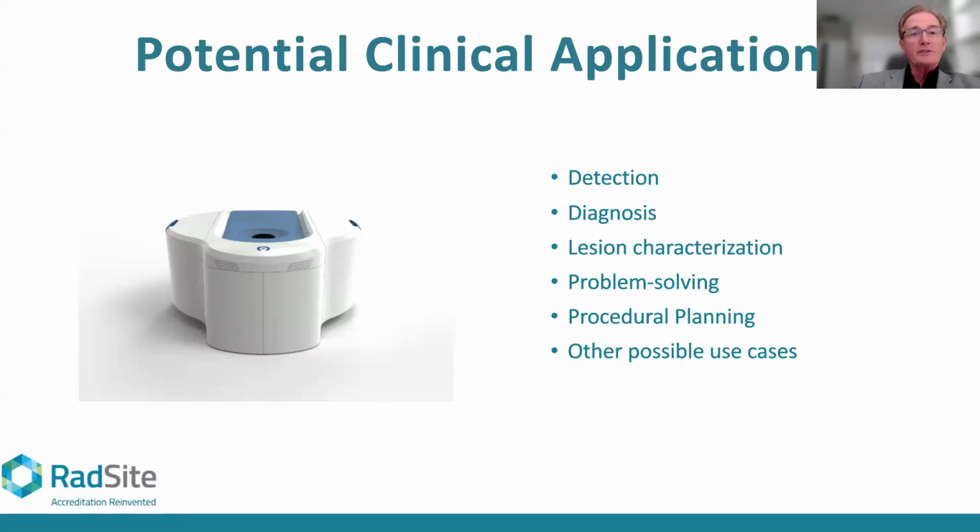And if we've somehow lost Andy in getting to the next step here, we can continue talking about this fascinating topic. One thing, David, as Andy may be coming on, I just wanted to comment in terms of potential clinical applications. Doctors Richardson and Reaven both gave excellent applications, one for problem solving, the other for implant imaging. And I suspect that early on, those will be the richest applications initially, as opposed to general use screening.